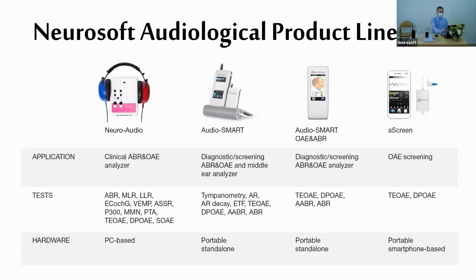Okay, so this is our audiological product line. And as I mentioned, today we will cover the second half of this product line, specifically AudioSmart devices in different combinations, and aScreen device.